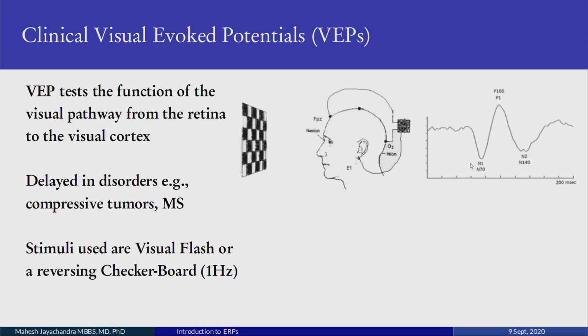We learned about myelin. So sometimes the body destroys its own myelin through an autoimmune process. That's a disorder. And the conduction failure occurs. First latencies become longer, and then finally you have conduction failure. The nerves don't conduct. But in the intermediate process, when the latencies are getting prolonged, you can easily see that here. In fact, for multiple sclerosis, visual evoked potentials are the diagnostic criteria.